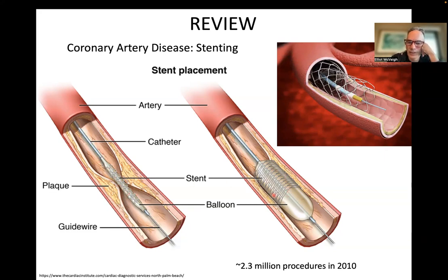And then fluid is injected into the balloon at a specific pressure. You don't want it too high because you don't want to bust the side of the vessel, that would be a disaster. That can happen. It's a very rare thing. But normally you inflate for a certain amount of time. This pushes the lesion, squishes it back towards the vessel wall. Remember, we're fully occluded at this point, so there's no blood flow going here. So you don't want to leave it there for a very long time. And then when this balloon is let down, there's a fairly wide open pathway.